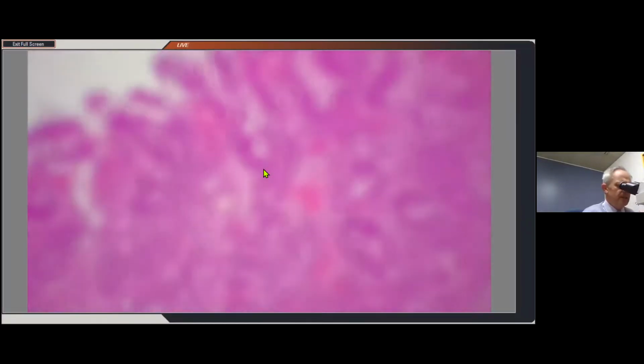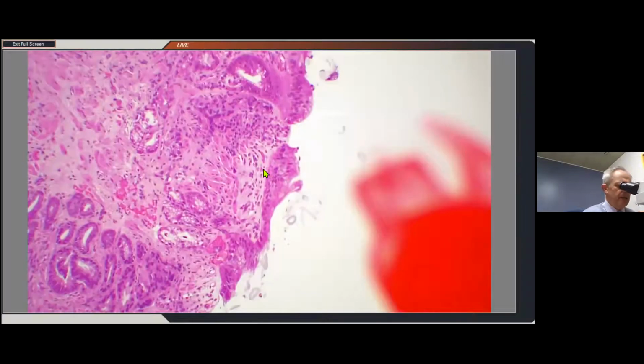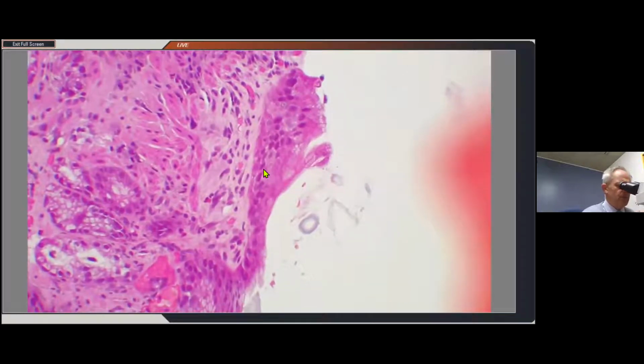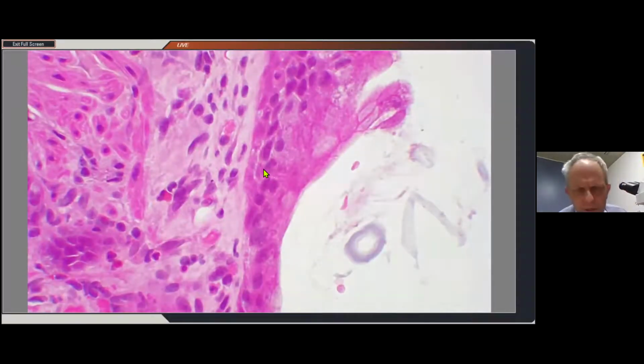Now, some of the other histopathological changes that we look for, and in fact, there need to be several. One of the characteristics is what we call the multi-layered epithelium. From a histopathologist's point of view, everybody knows or should know about squamous metaplasia that occurs in the cervix.